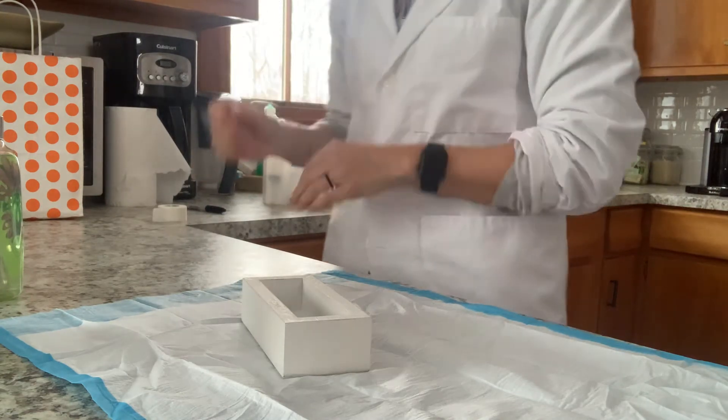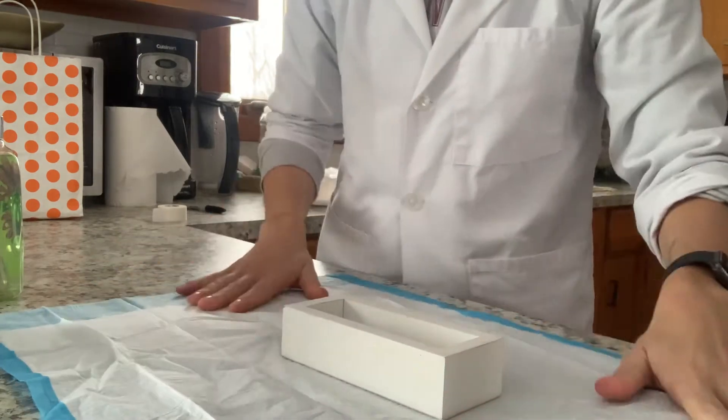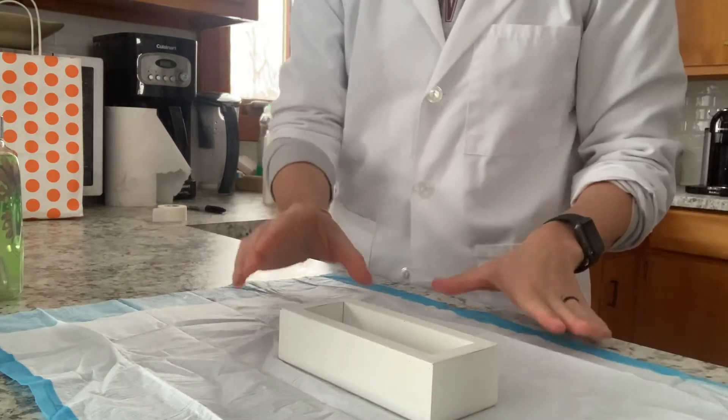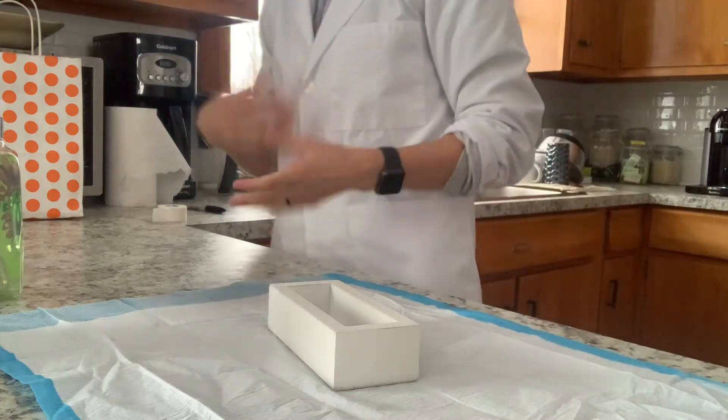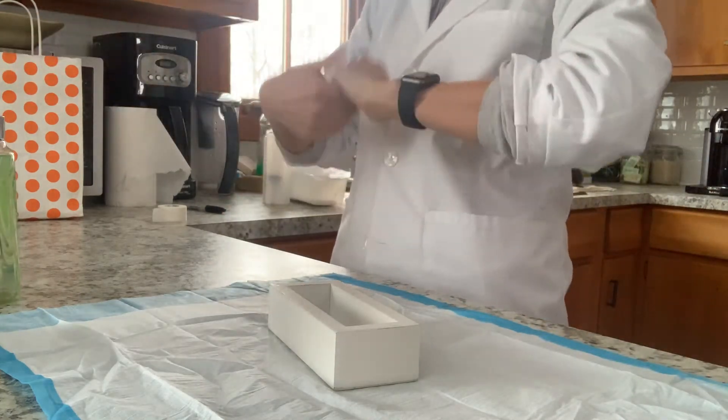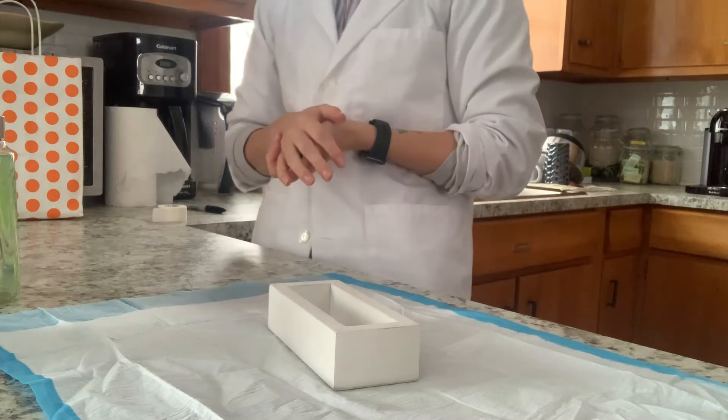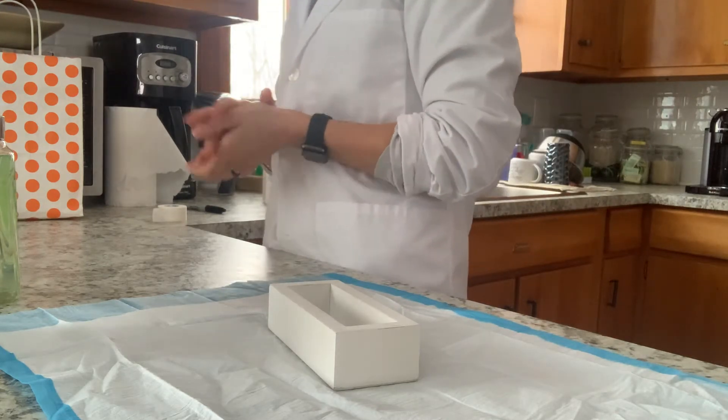And then I'm going to put it inside, trying not to touch any of the side of the culture swab. And then I would put that in the bag and I would send it off to the lab. And then I will take these gloves off, throw them in the red bag, get this out of the way. So now that my patient's clean hands again. And now I'm going to move on to the sterile procedure of the dressing.